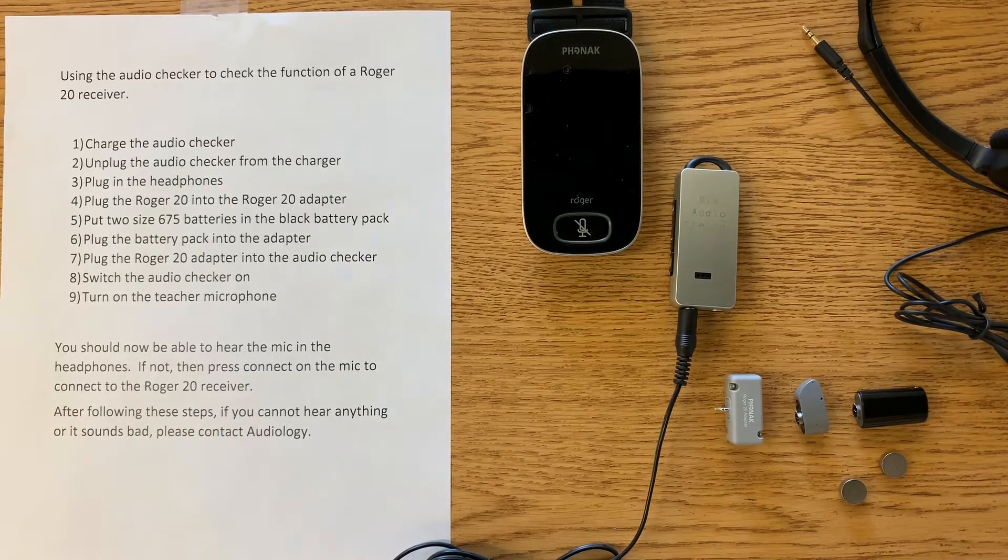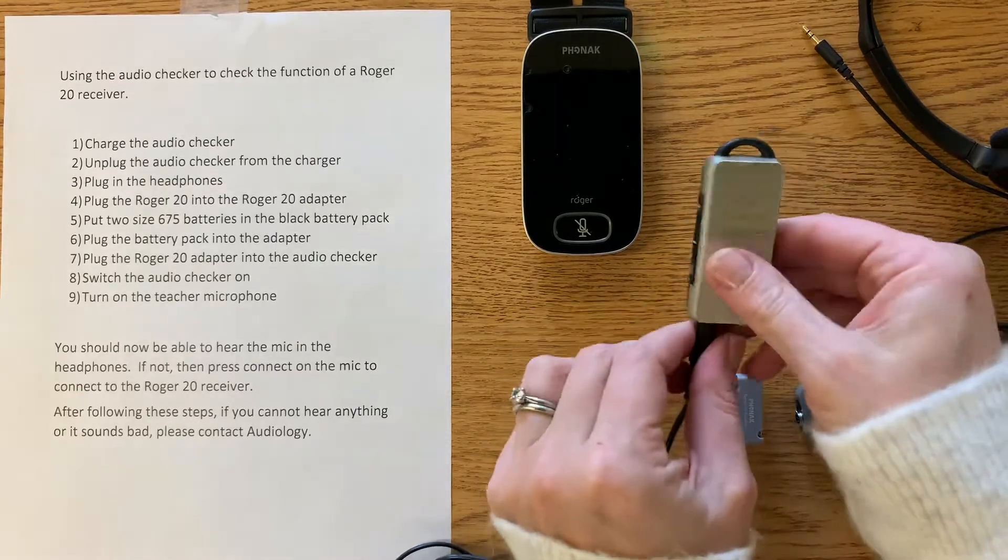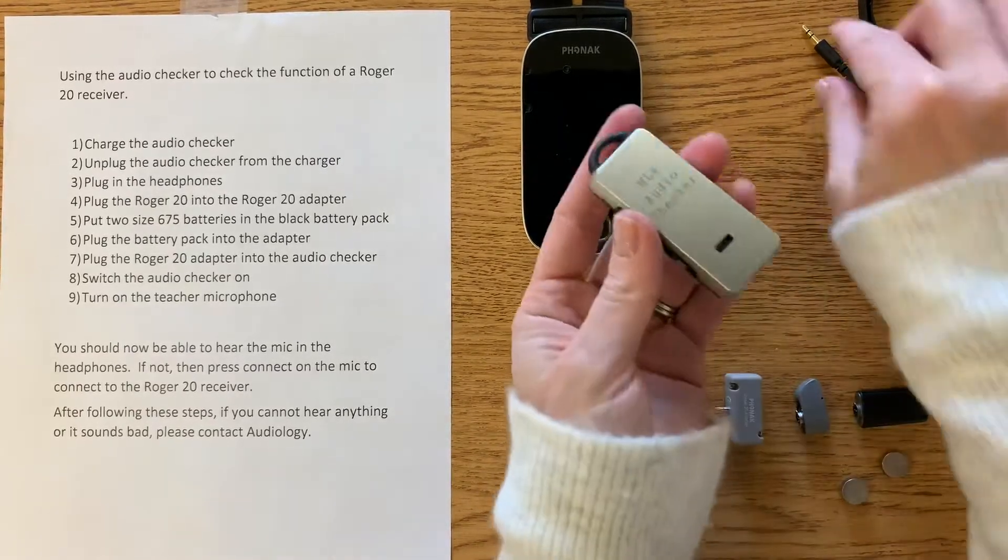I'm going to show you how to use the audio checker to check the function of a Roger 20 receiver. First, the audio checker must be charged. This one is already charged, so I'm going to unplug it from the charger and plug in the headphones.